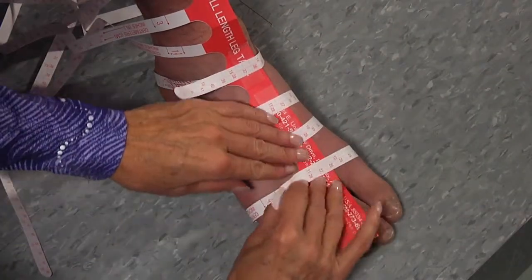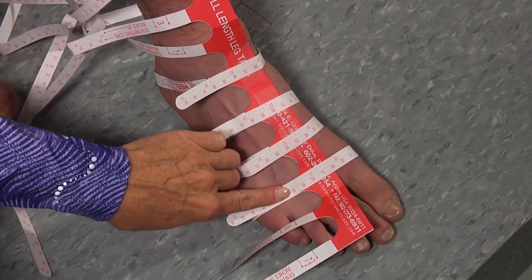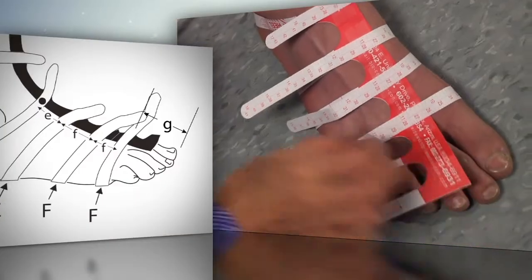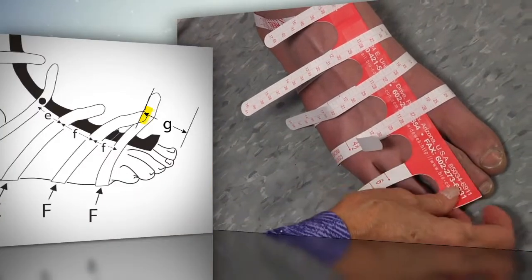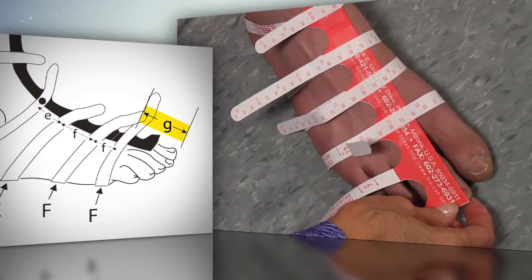You always take the last circumference of the foot around the metatarsal heads, never past them. The little g measurement is the distance between the circumferences of the bases of the toes out to the tip of the longest toe.